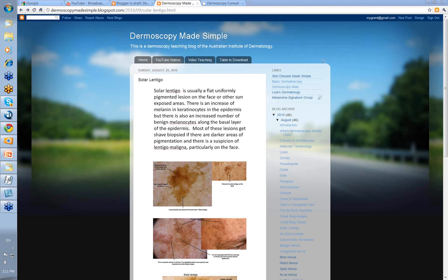In Australia, solar lentigos are awfully common. We get a lot of sun damage and they can vary in color from light brown to dark brown, almost to black. And because they're so common, they're often seen in association with other lesions. Let's look at some simple solar lentigos.